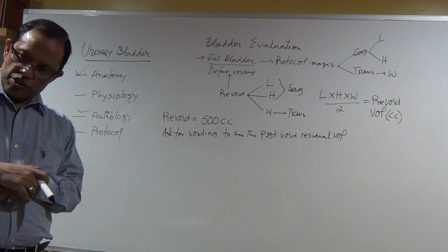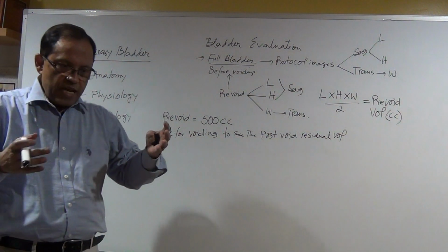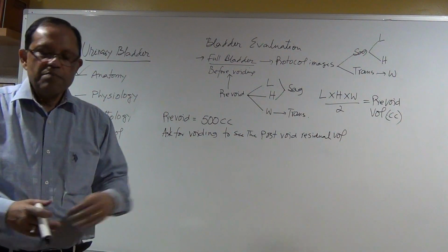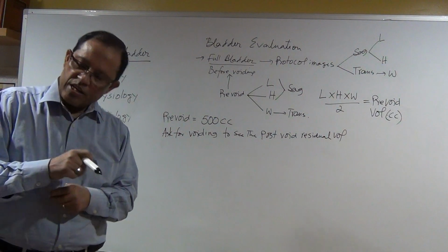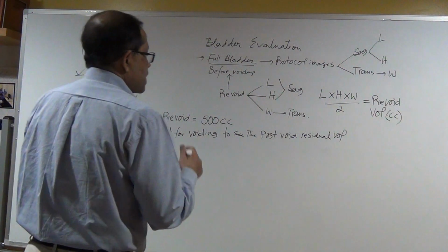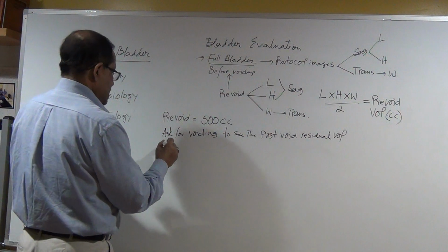What is post void residual volume? Suppose that I completely empty the bladder, I should not have any urine in the bladder, right? But still there is some amount of urine. That is called post void residual volume. You got it? So now, calculation of post void residual volume. Keep that in mind.